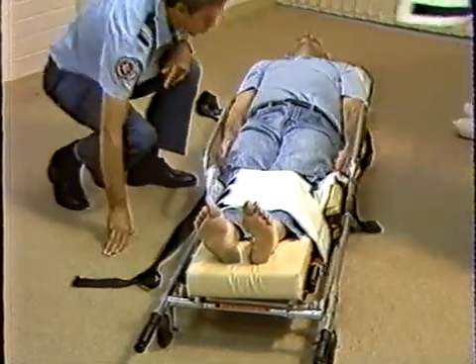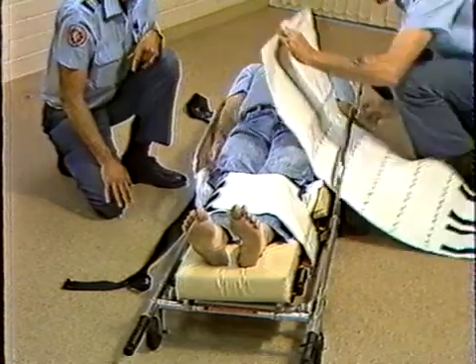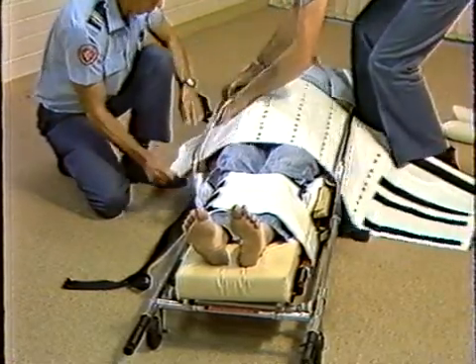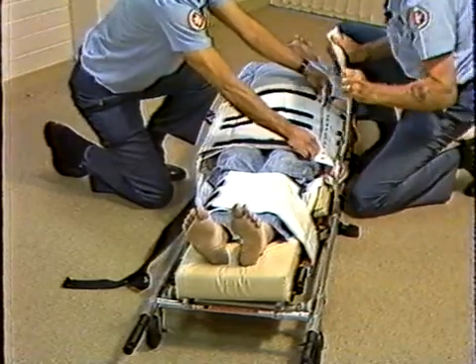Next one is the big one. Once again, the leading edge. And this one, all we have to do is go under the rails, over the chest and back over again. Nice and firm.